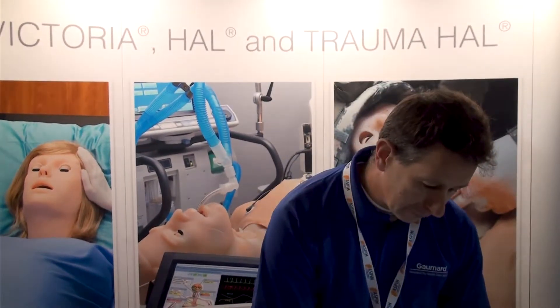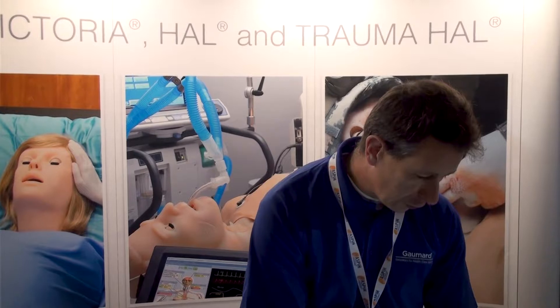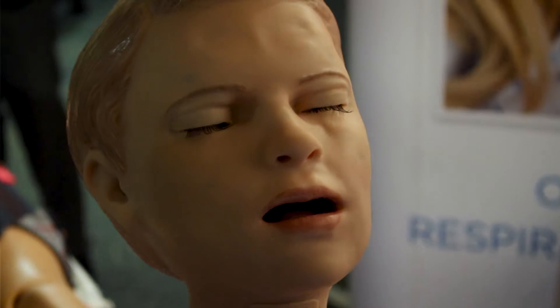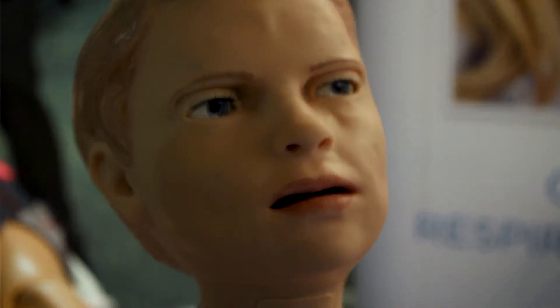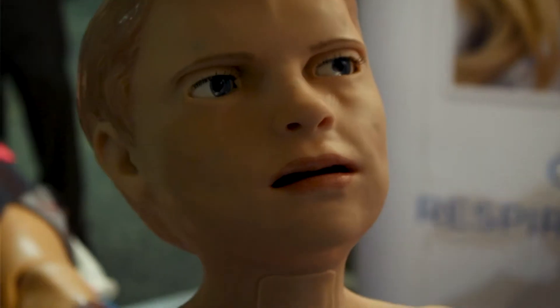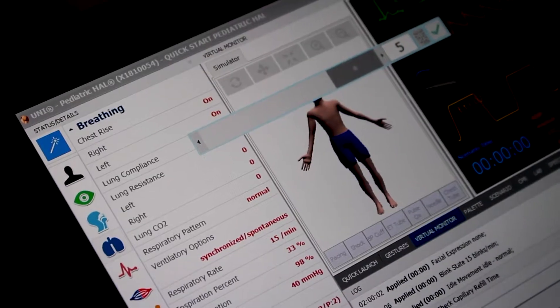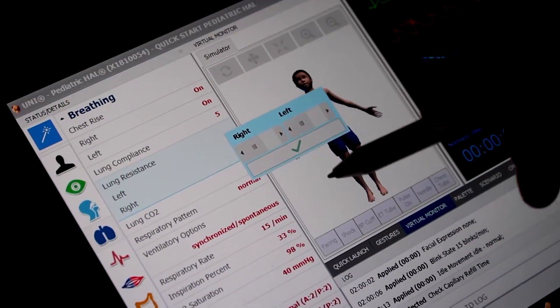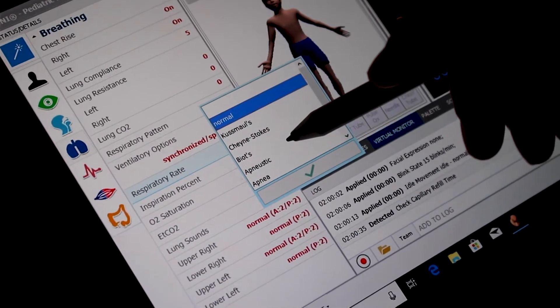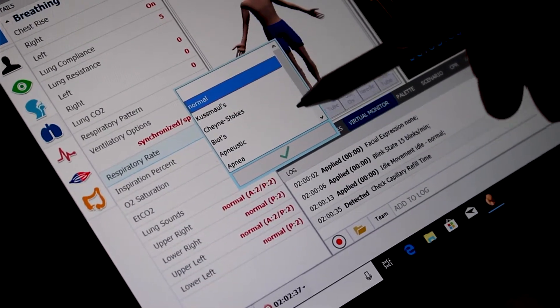He can also change his pupil dilation and change his facial expression. You can change his blink ratio from five blinks a minute up to about 25. You can also change his tracking eyes.